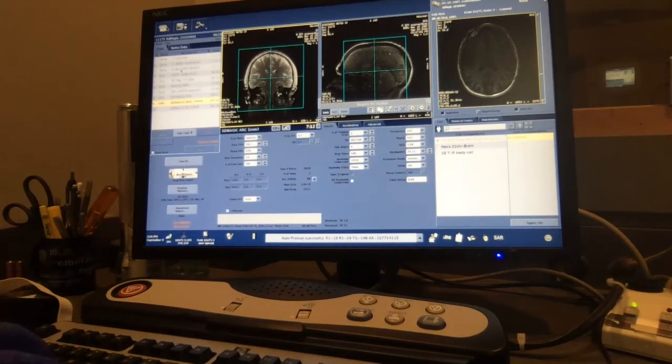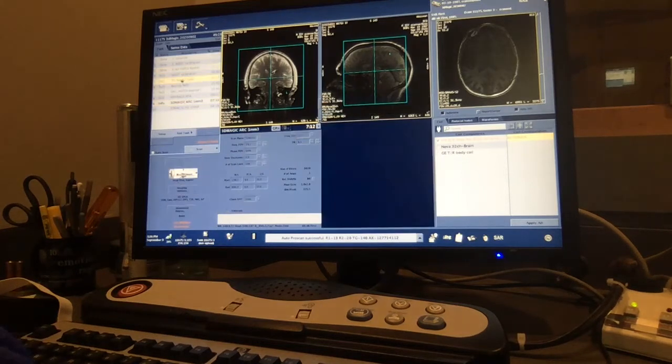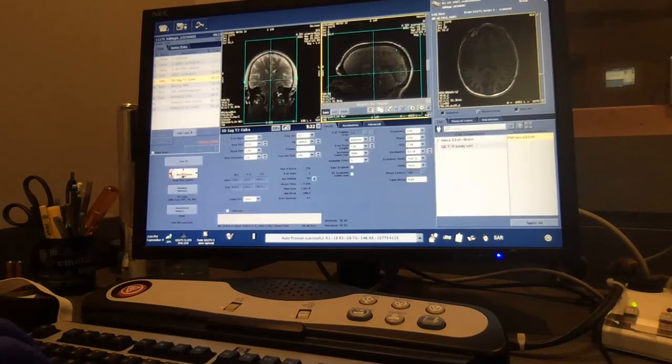I'm going to get this other scan started, and I'll show you a little bit more of this image. The next scan that we're going to acquire here is a T2 weighted image. Again, you see that the field of view is set to 25.6 centimeters with a slice thickness of 1 millimeter. Our TR now is 3,000 milliseconds. We have the echo time set to maximum, which in this case, if you hover over the variable, is 93 milliseconds. And again, 256 by 256 lines of K-space.